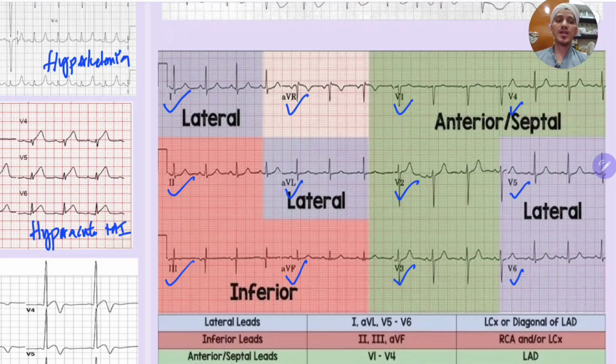Okay, there will be 6-channel and 12-channel ECGs also, with bigger ECG papers. But commonly used ECGs in primary clinics and in higher centers in emergency rooms also, it is the 3-channel ECG. You will get a 1-channel ECG also, where you will get only one strip, and that will be a very long ECG. So the 3-channel ECG is the most common ECG.